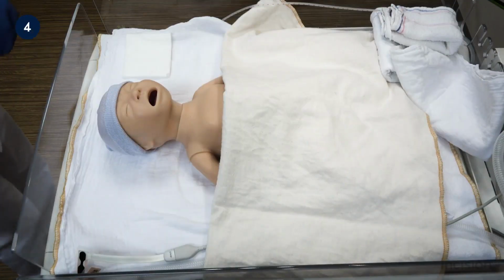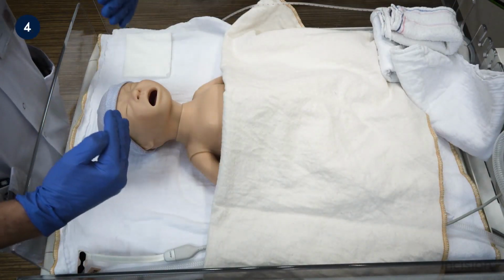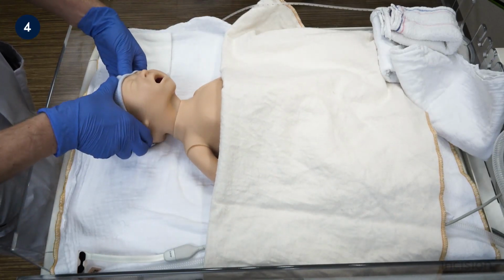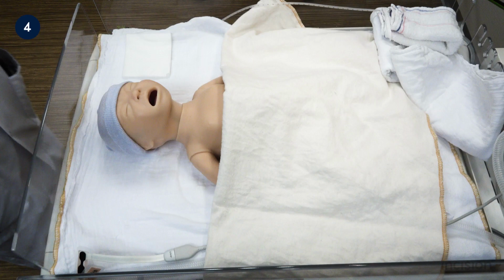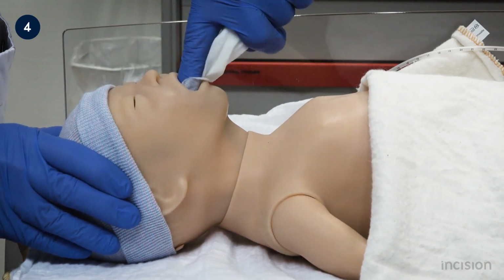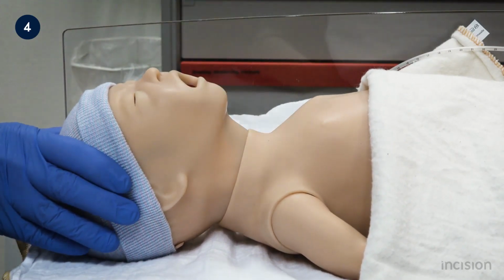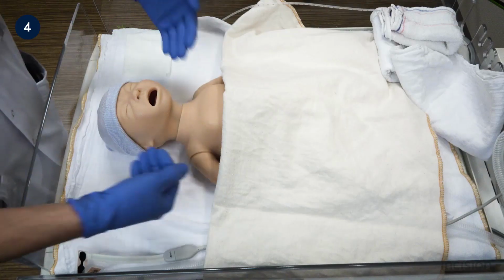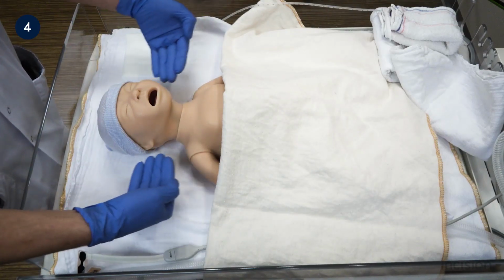To facilitate adequate breathing, the newborn's airway must be open. A closed or obstructed airway may be a result of the position of the newborn's head, a jaw with low tone, or direct mechanical obstruction. If the newborn is not breathing adequately, or at all, the following steps are performed. The newborn is placed in a supine position with the head in the neutral position.